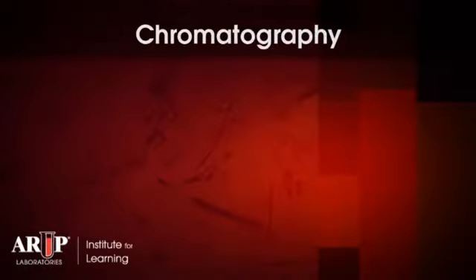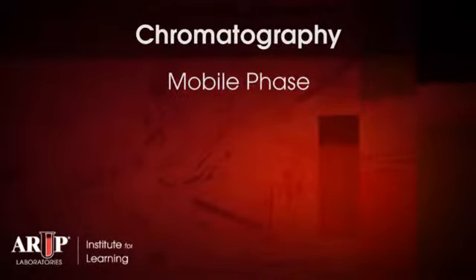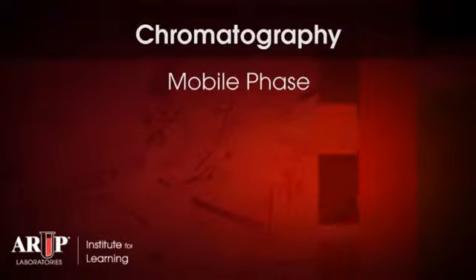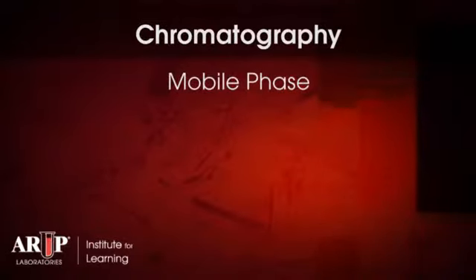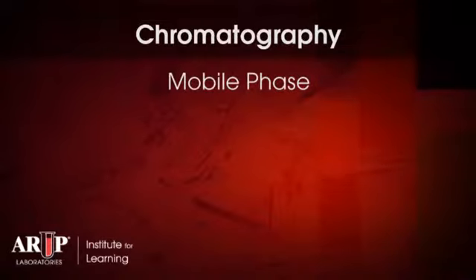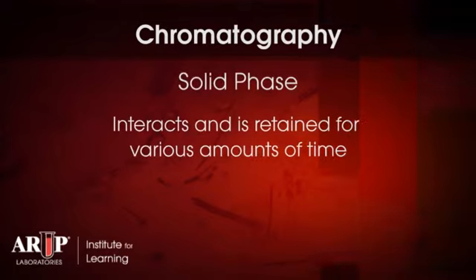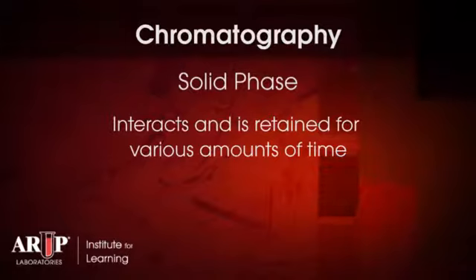Another approach to drug testing is to separate the components of a biological matrix and identify those components individually. The most common way to separate components in a biological matrix is with chromatography. Chromatography, by definition, includes both a mobile phase and a solid phase. The mobile phase is typically either liquid or gas, and the components in a biological sample will migrate in that liquid or gas phase. Those components will then interact with the solid phase and be retained for various amounts of time.